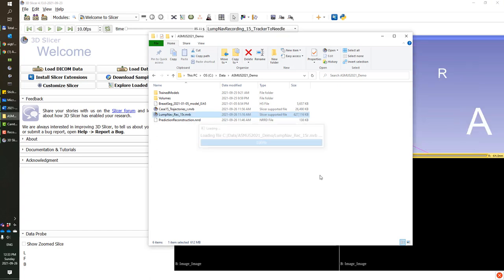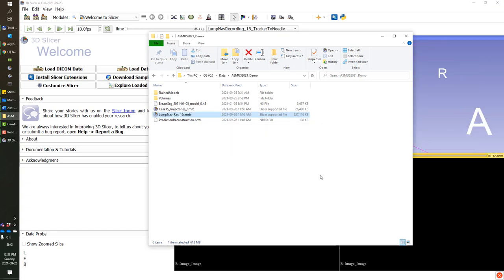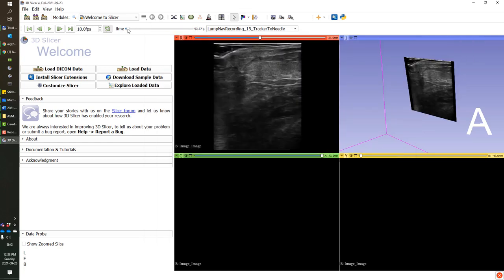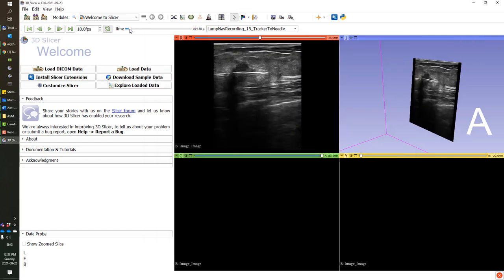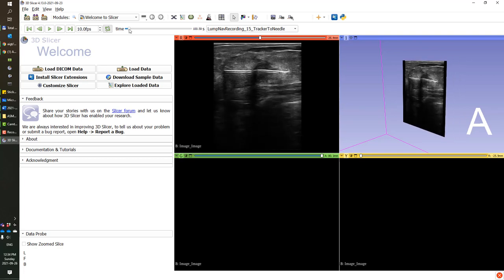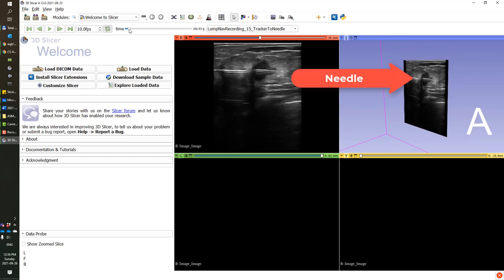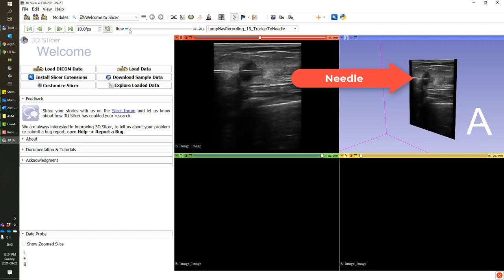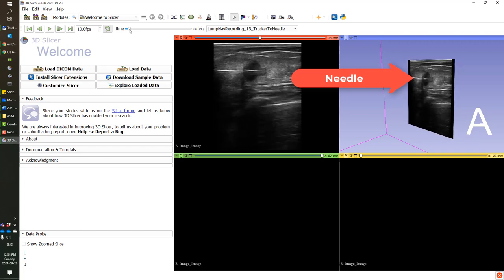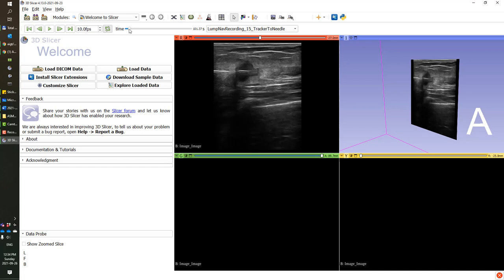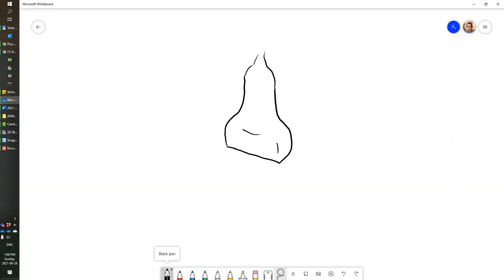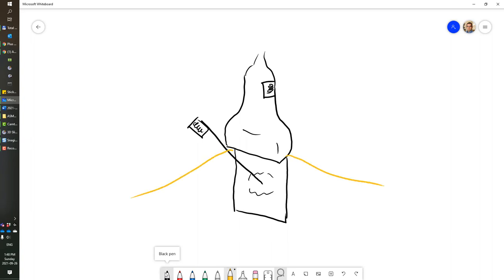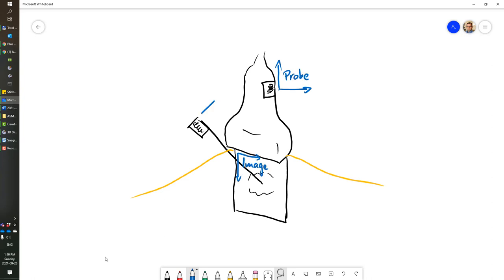The ultrasound images are tracked. If we replay the ultrasound recording, you will see that the needle in the tumor appears to be motionless while the ultrasound is moving. That is because we visualize the data here in the needle coordinate system. We have a tracked ultrasound machine producing images and a needle in the tumor. We track the needle and the ultrasound with an electromagnetic position sensor.